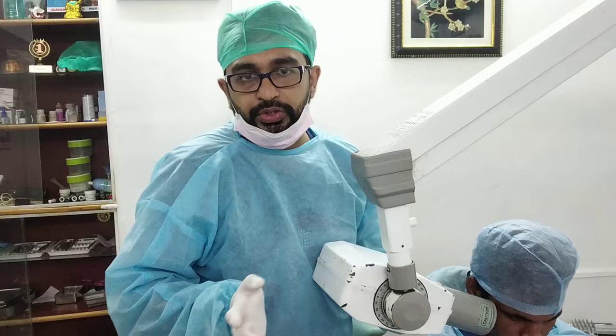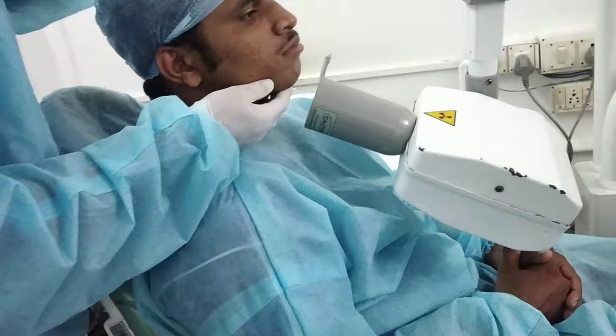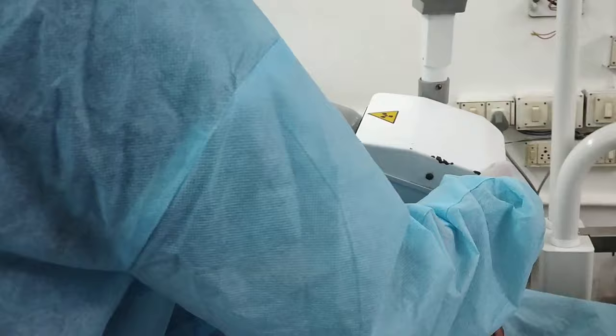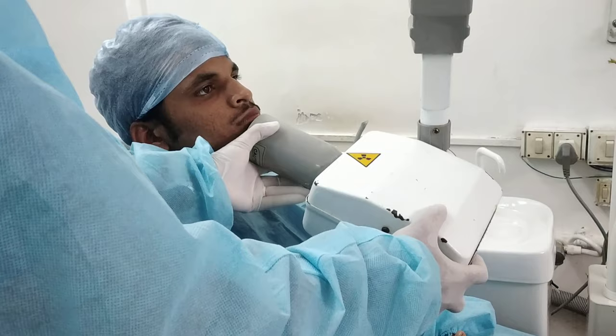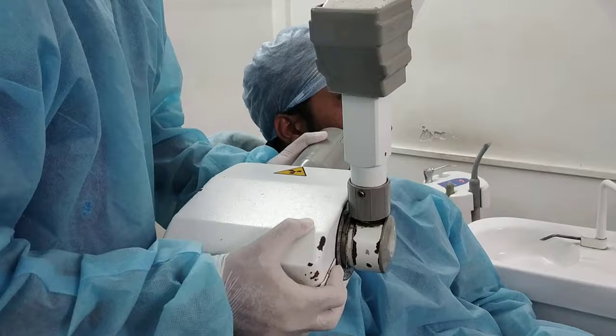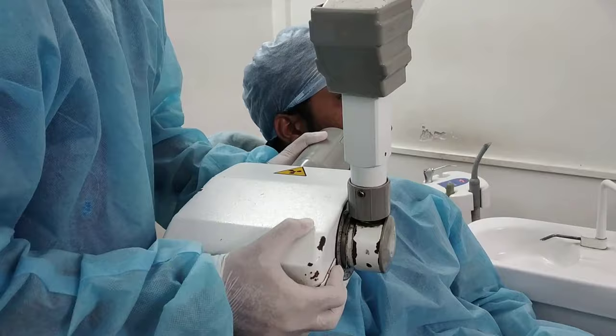Now we will move on to the lower anterior teeth. For the lower anterior teeth, I will tell the patient to tip the head slightly backwards. When taking lower anterior teeth, I place the x-ray cone at this angulation to achieve a perfect radiograph. Similarly for the lower canine, you shift the cone accordingly, then again for the premolars and molars you shift the cone to the appropriate position.